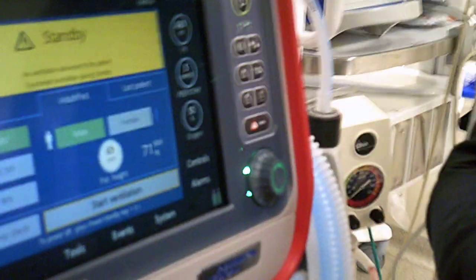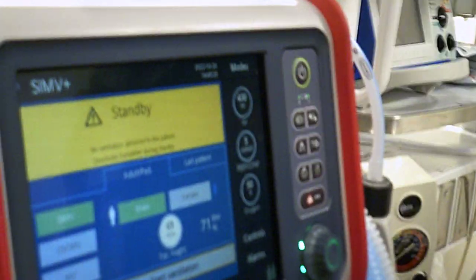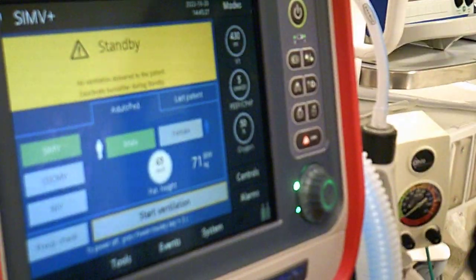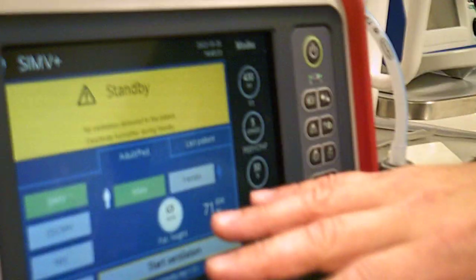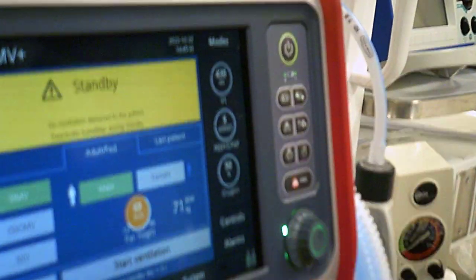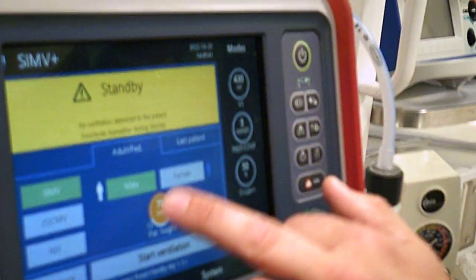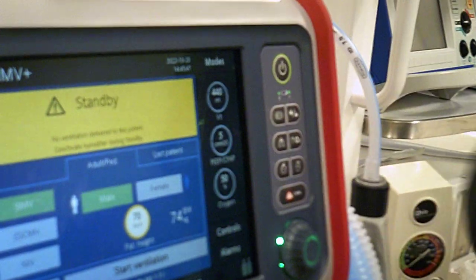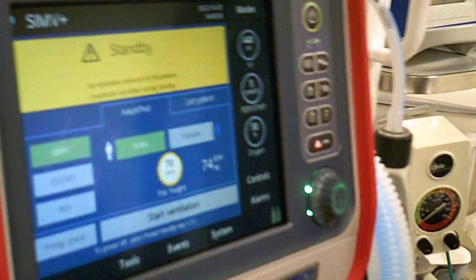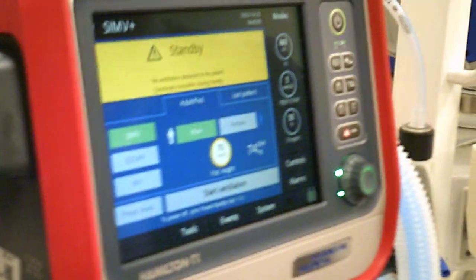For the ideal body weight that we went over, the real quick way, she got tape measures. And I get looked at really weird, but every patient I go to, I take out a tape measure from head to toe and I measure them. And I have it in inches, so I will come here, female or male, whatever. I set my inches, and my ideal body weight's done for me. But I really want you guys to know where that comes from, right? That's good for that one.